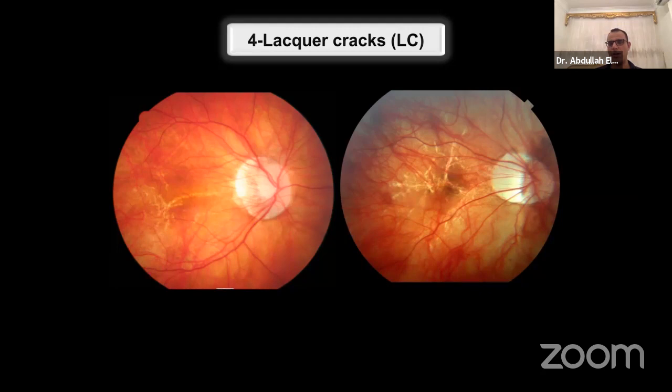There are two conditions actually which may mimic each other. One is dome-shaped macula, and the second is eyes with inferior posterior staphyloma. In these conditions you may find a small cuff of subretinal fluid within the macula. The cause for that is unknown. There is some speculation about constriction of the choroid or some disturbance in the choroidal circulation, or changes in the choroidal thickness. My feeling is that this is more or less a structural change related to the asymmetric expansion of the globe. There are several reports of trials of anti-VEGF for these cases, which usually don't work.